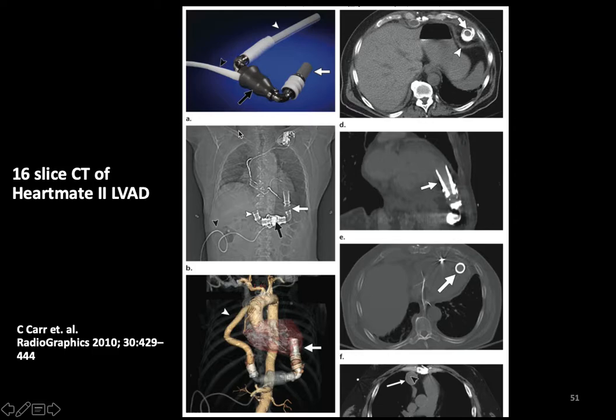So one question is, does it all fit? There are some structures that you can move around and some structures that you can't. So does it fit within the rib cage? How much do you have to displace the lung or the mediastinum? How do you burrow cables in and out? These people then wear battery packs that power this. And so you're going to have access to that.